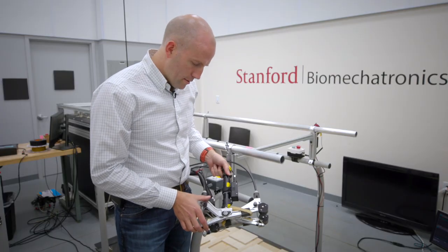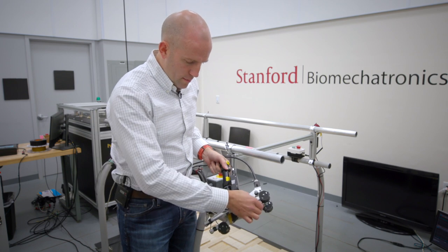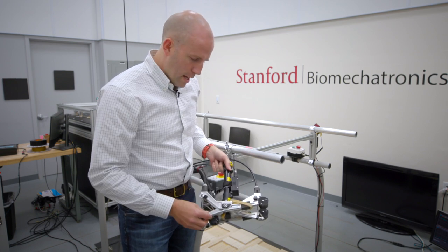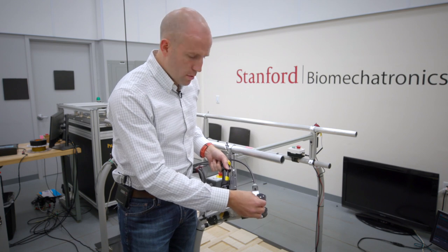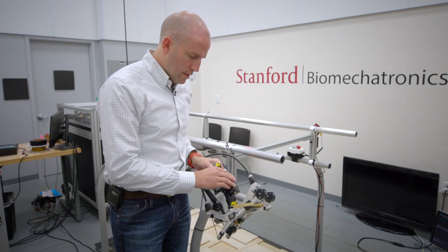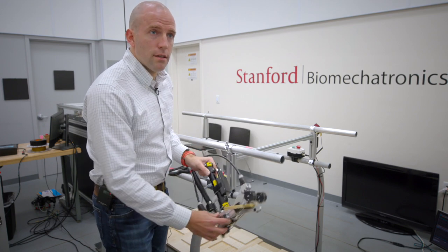The prosthesis has sensors to tell where the toes and heel are in space, sensors to tell how hard the toe is pushing on the ground, and an IMU that senses where the device is in the lab space.